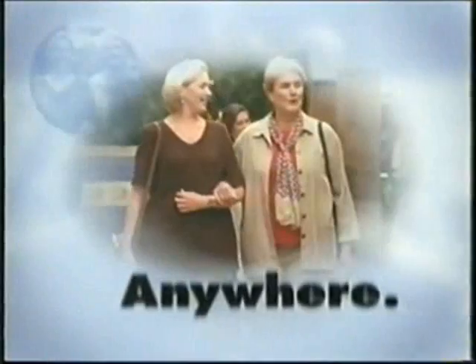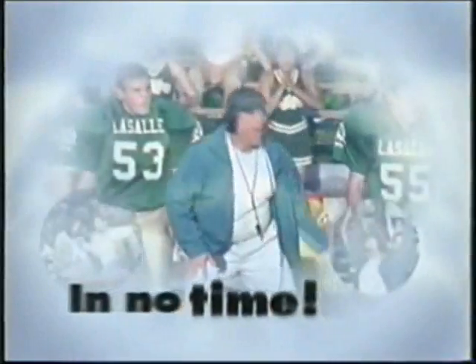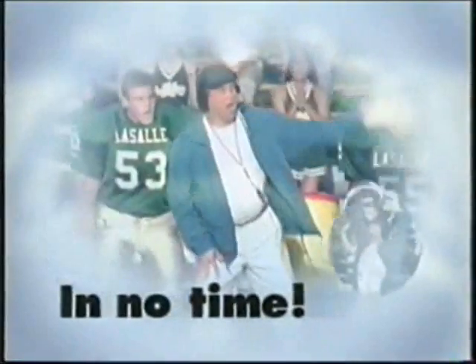My name is Amy, and I'm a diabetes educator. I'm here to show you how the convenience of the pen makes it easy to dose anywhere, anytime, in no time.